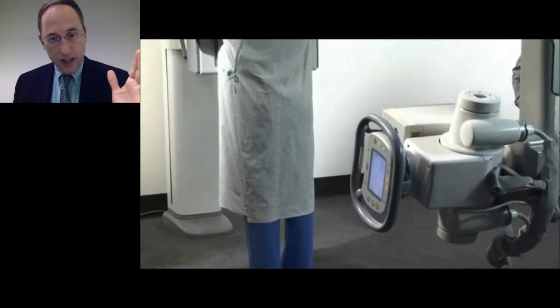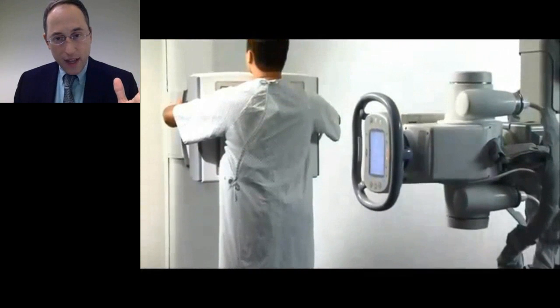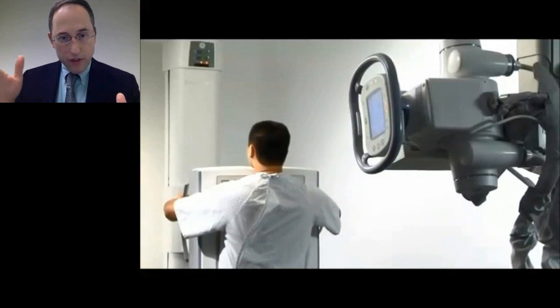Okay, so this patient's standing there. The machine is moving. It takes about 8 to 12 seconds, and while it's moving, it's constantly taking multiple radiographs that are getting read out from the detector. Okay, and that's it. That's all that's required to do your back projection and obtain your slices.